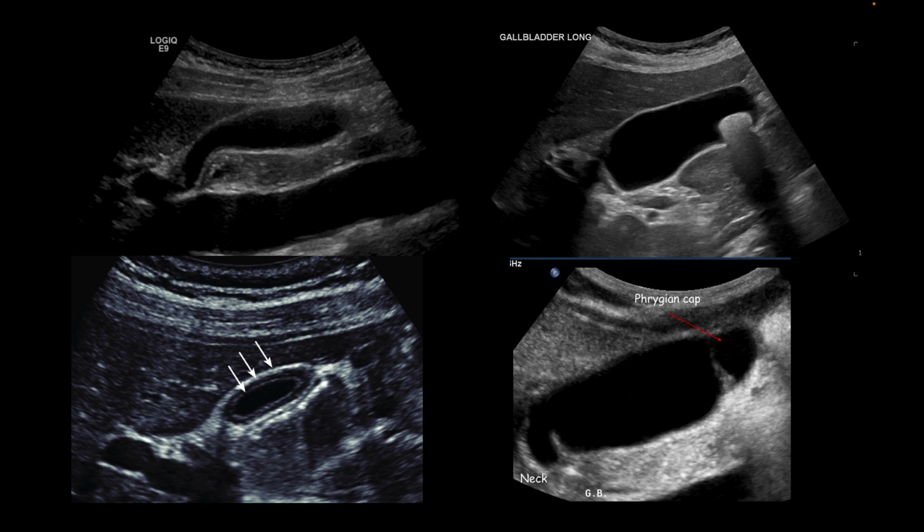Top right of screen, we have a gallbladder that contains a stone in the fundus of the gallbladder. You can see the stone is nice and bright, hyperechoic with a shadow behind it, and that is a classical gallstone. However, that stone's probably not causing that particular patient many problems in that position. It may intermittently be obstructing the gallbladder, but not where it is at the moment. And so we'd want to roll the patient, make sure it's mobile, but stones are so common in middle-aged people that could just be a normal, innocent gallstone.